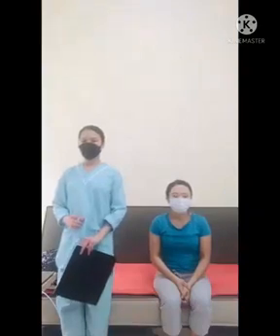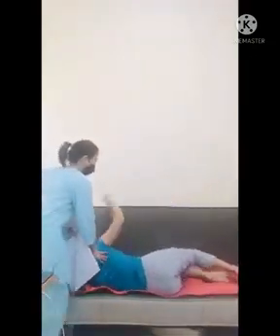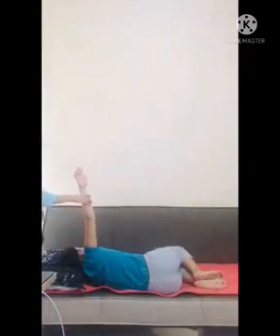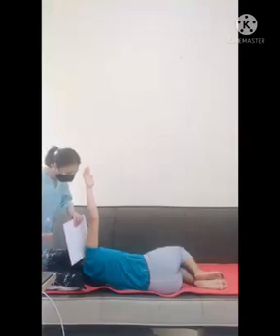The fourth in this projection is the infero-superior axial projection, Clements modification. We're going to position the patient lying toward the unaffected side. Flex po natin yung hips natin, nakaganyan. The hand must be flexed toward the ceiling. The IR is placed against the superior aspect of the shoulder and unaffected arm. We're going to hold the image receptor, which is 8 by 12.